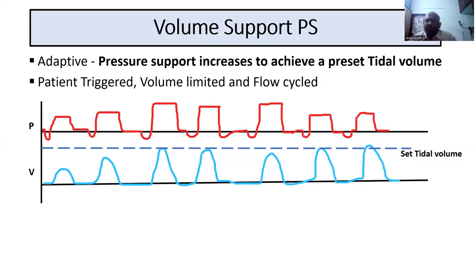If the patient is starting to improve or he is taking good effort more than this, it will start to reduce the pressure support and achieve the same tidal volume. So that is how the volume support works.